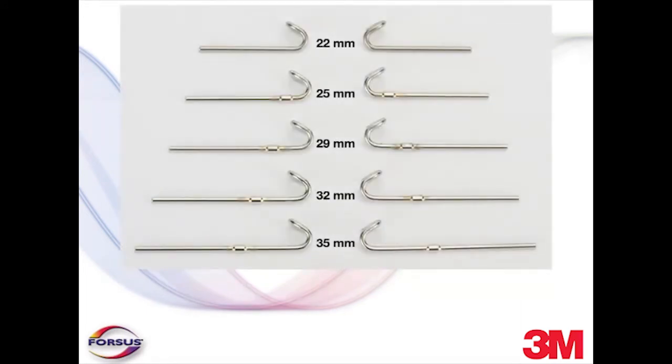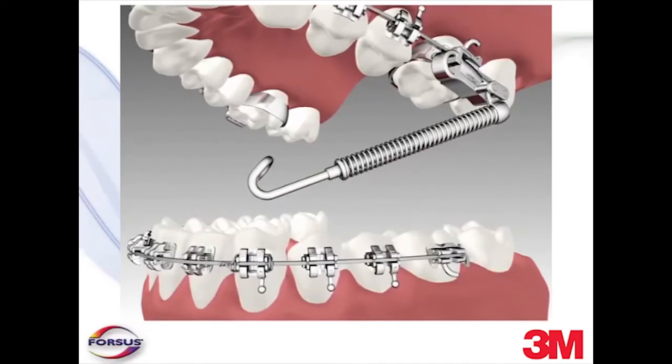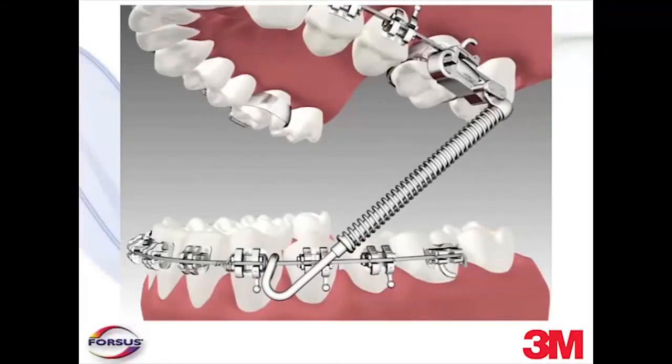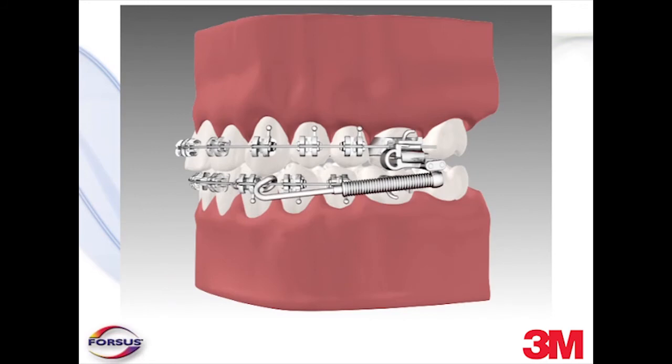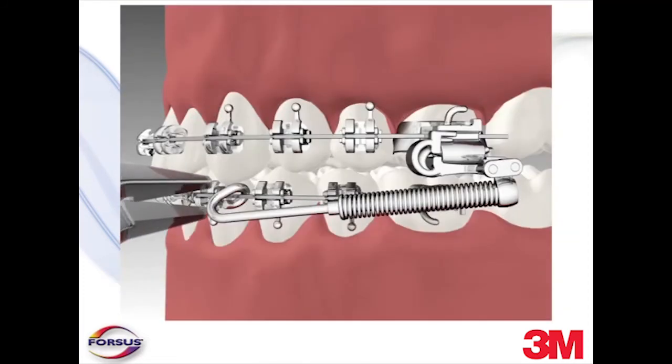The pushrods are available in different lengths and are selected based on the measured value during advance preparation. After selecting the correct pushrod, place the distal end of the pushrod into the opening on the mesial end of the spring module, then place the mesial end of the pushrod onto the arch wire. As a final check for correct pushrod sizing, with the jaw closed in centric position, make sure that the distal end of the pushrod does not extend distally from the spring assembly and that the spring is not fully compressed, with approximately one millimeter of activation remaining. The spring assembly length after installation should be 20 to 22 millimeters. If the pushrod protrudes distal of the spring module, it is too long — select a shorter length. To secure the pushrod onto the arch wire, simply close the mesial loop over the arch wire with the Weingart pliers.